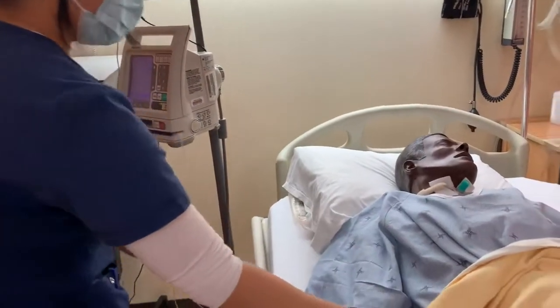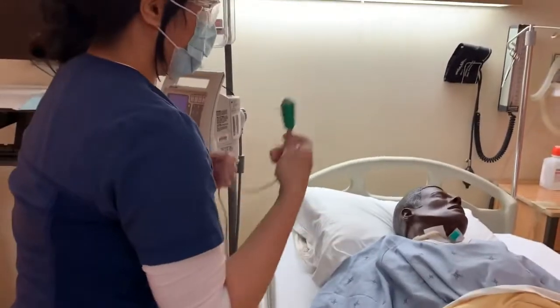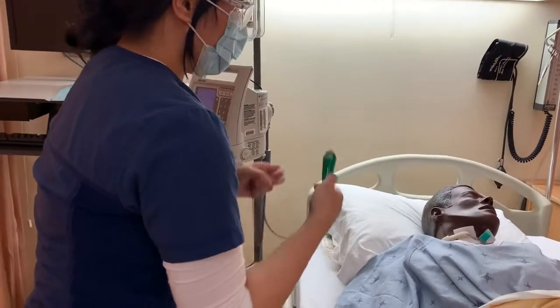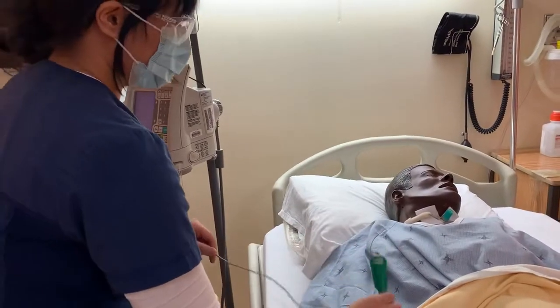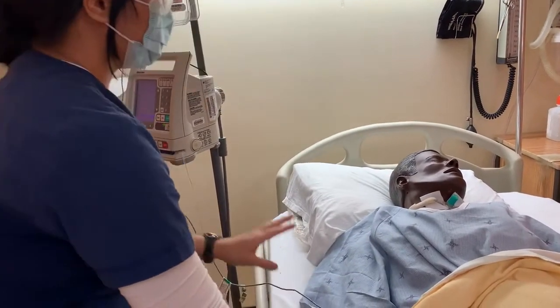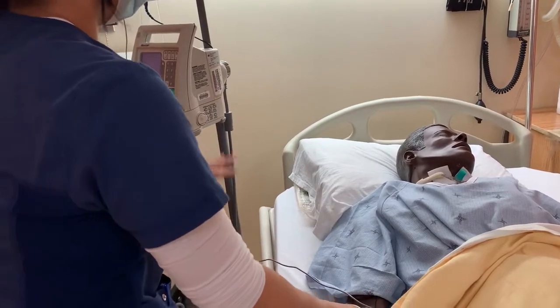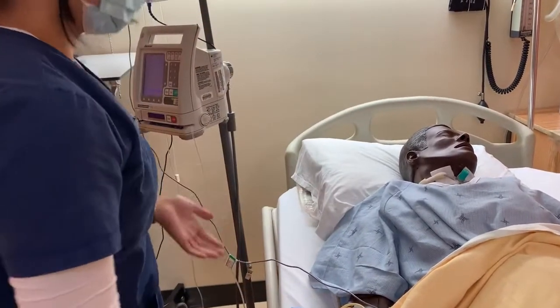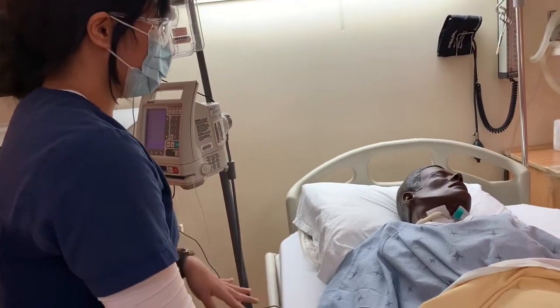So, Ms. Paris, this PCA button right here, this is your PCA button. You can push it every 5 minutes, and only you can push it, not a nurse, not your family members, just you. And it's a safety feature because we don't want you to get overdosed. Is that okay with you? Okay. So, and your call bell is right here. If any of those side effects happen, the dizziness, the headache, shortness of breath, definitely let me know.